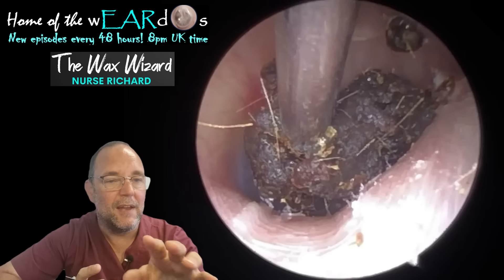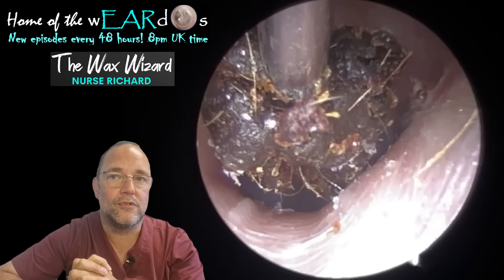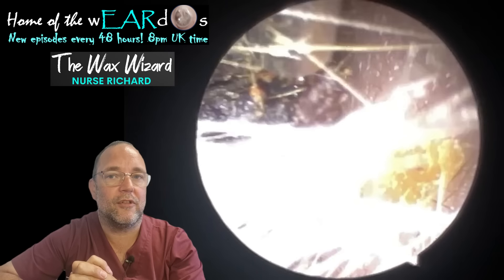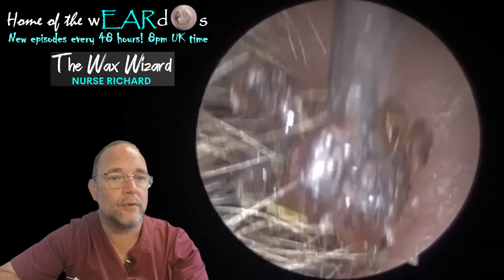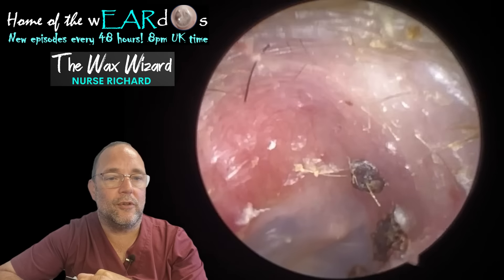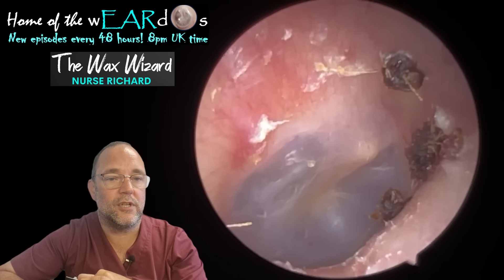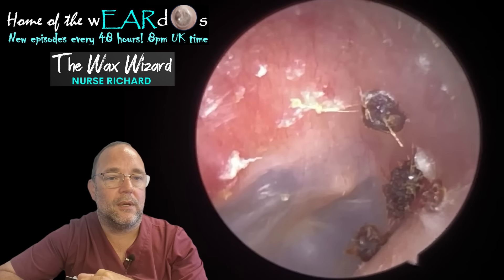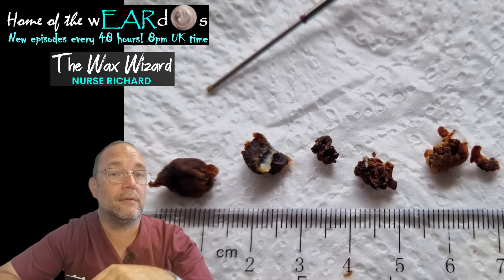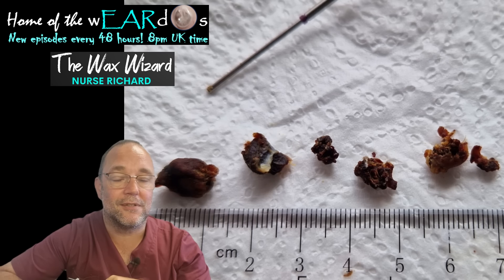You can already see the little speck there. If they were in a spot that I thought had potential problems — if I thought it was on the eardrum and possibly creeping into a pocket — then yes, obviously I would act. But none of them were. As you can see, you can see the whole eardrum there and those specks are microscopic — they're really tiny. Oh, ruler shot for once — yay me! I actually remembered with this one because they were fairly substantial chunks, very dark too.